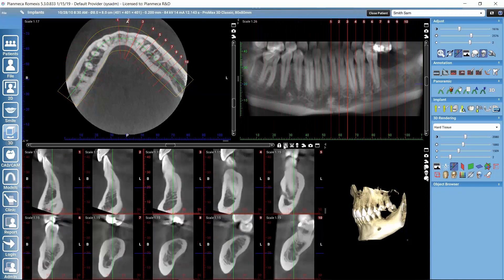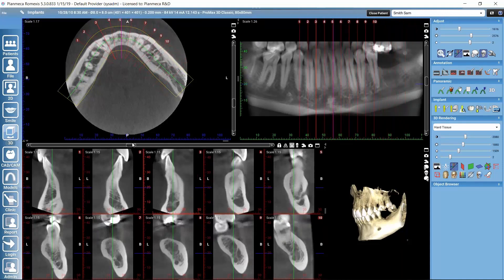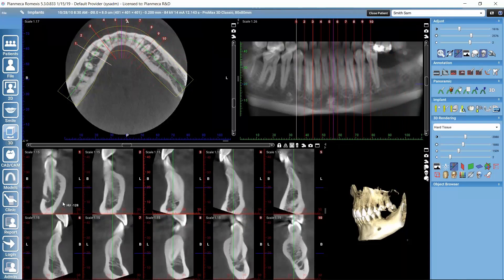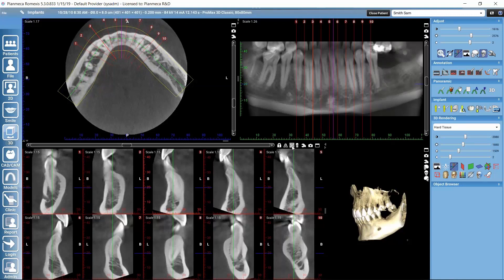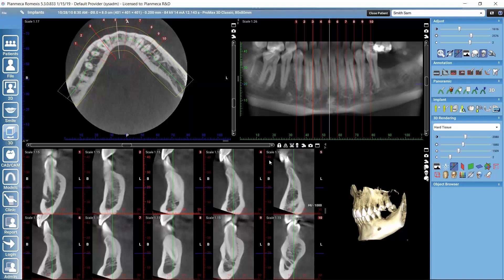I can also mirror the slices just like in other views. There's also another mirroring option that mirrors cross-sections according to the apical point on the dental arch — when I move the cross-sectional stack, the slices on the other side are mirrored differently as they pass through that apical point. There's also an 'Implant Centric View': if we have an implant or segmented tooth in the plan and activate that object, this view produces two slice views centered on that implant or segmented tooth.